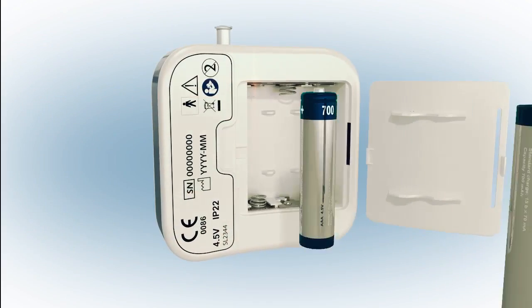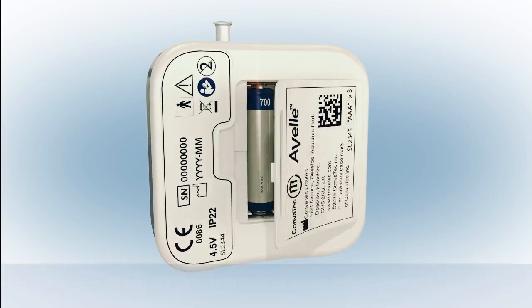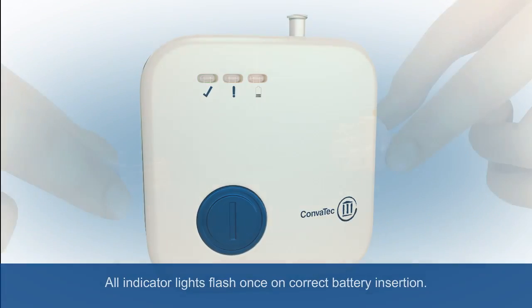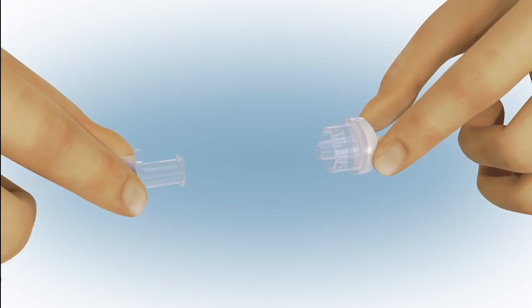Place the batteries as indicated in the battery compartment. All indicator lights will flash once. Next, connect the dressing to the pump.